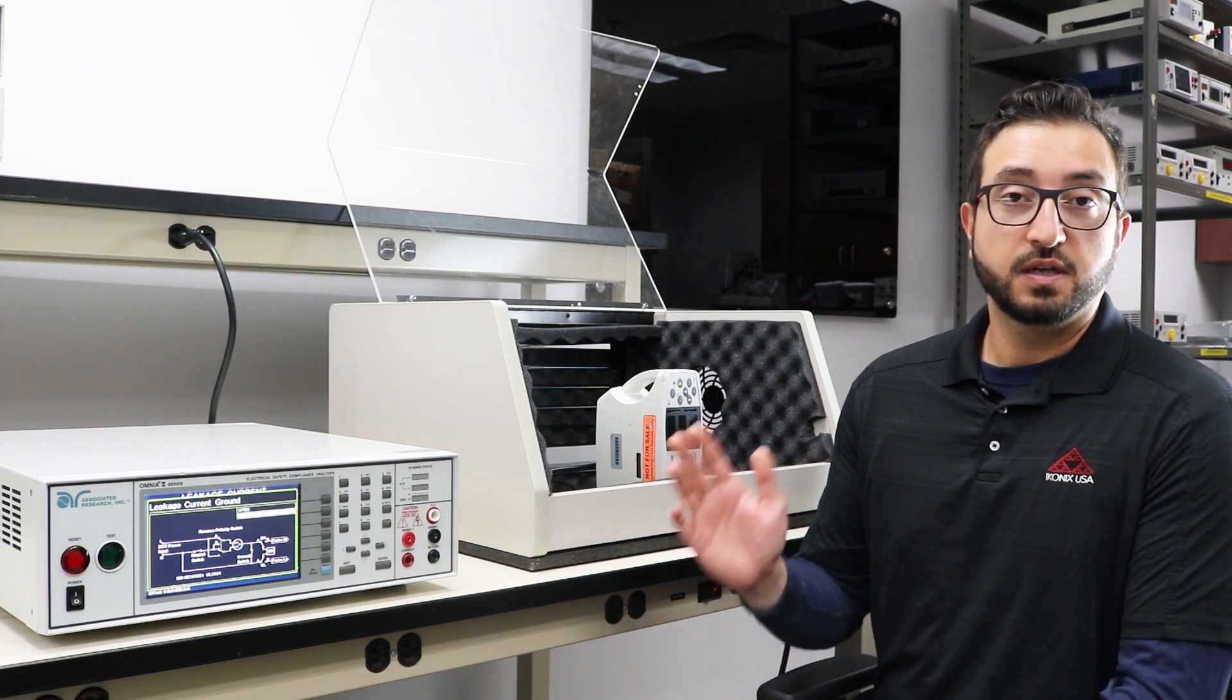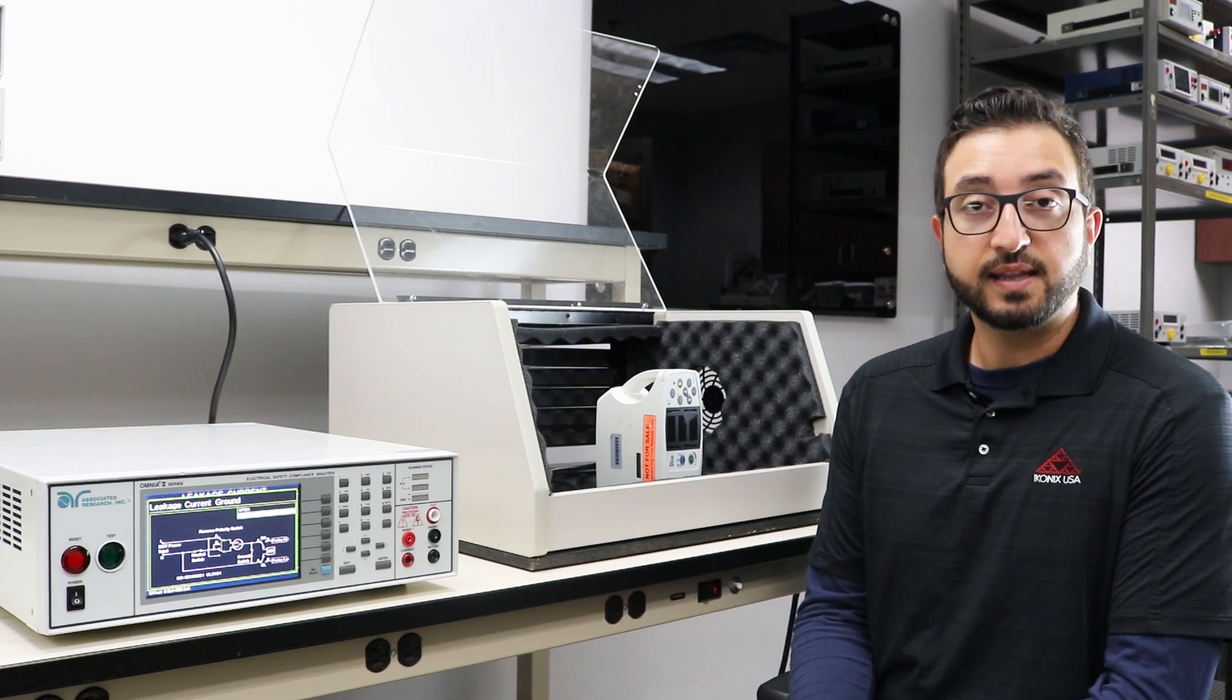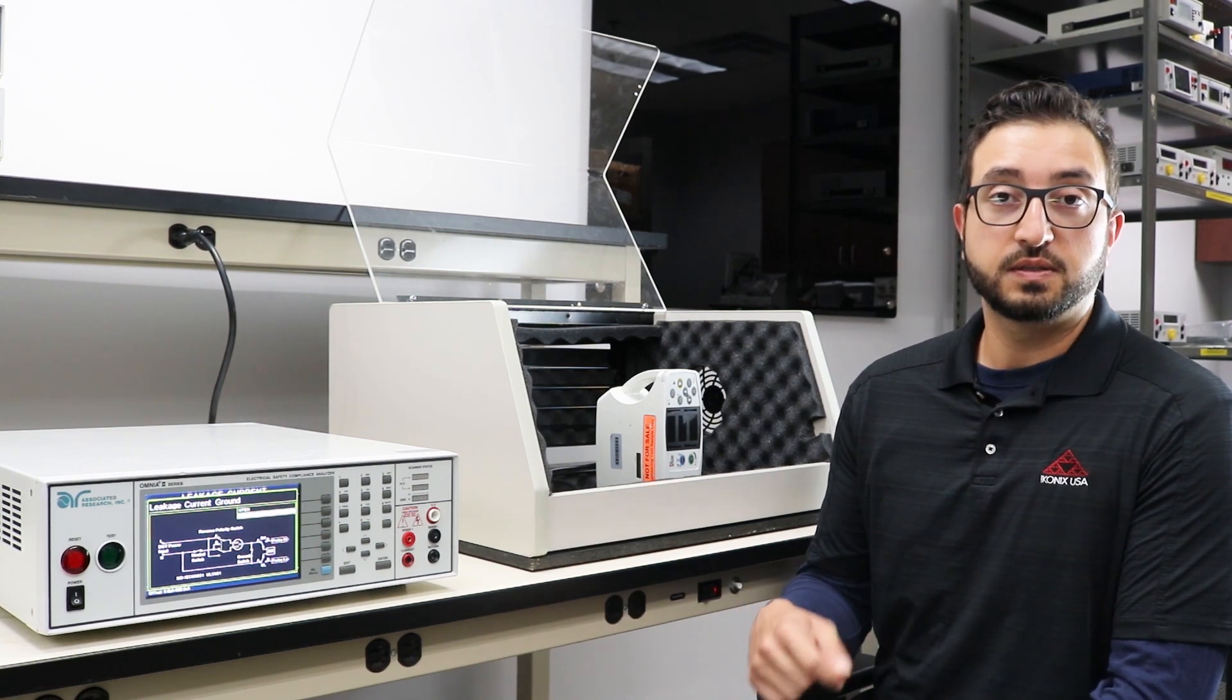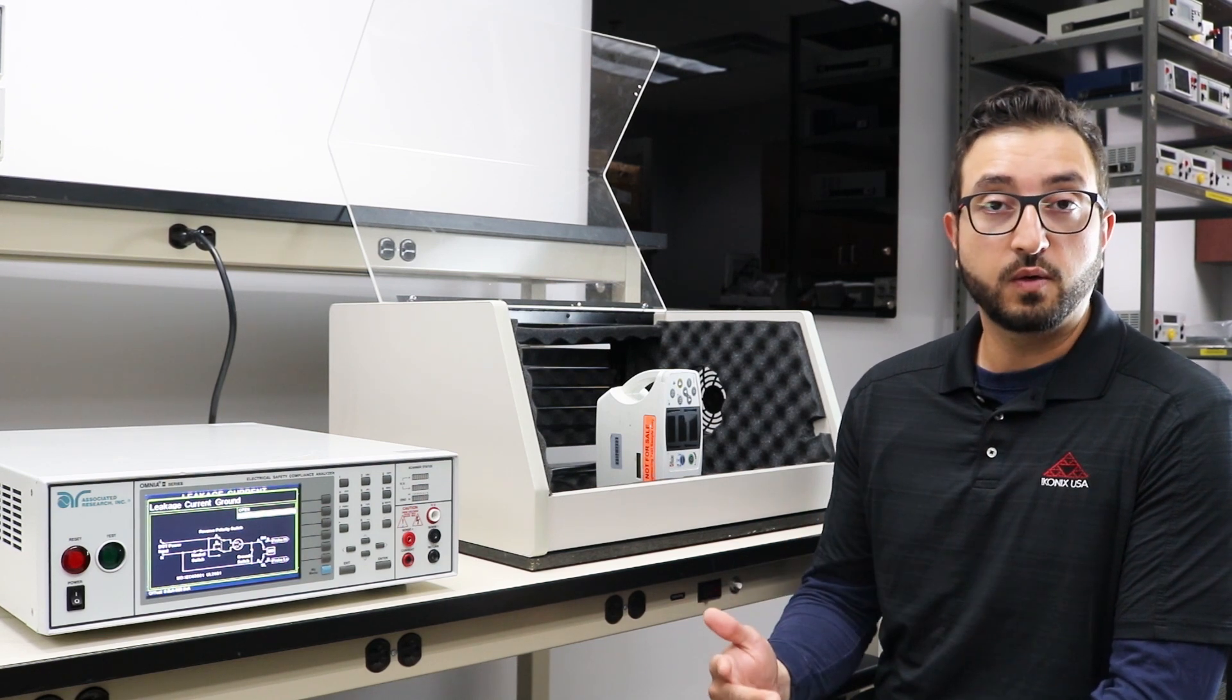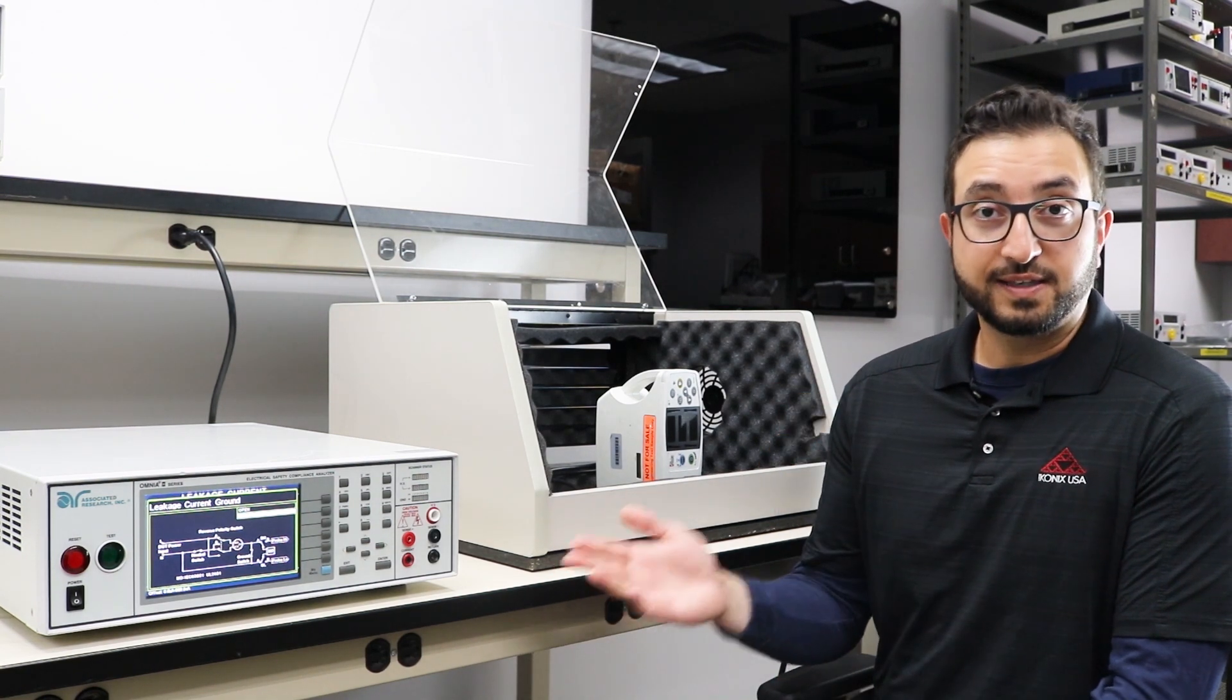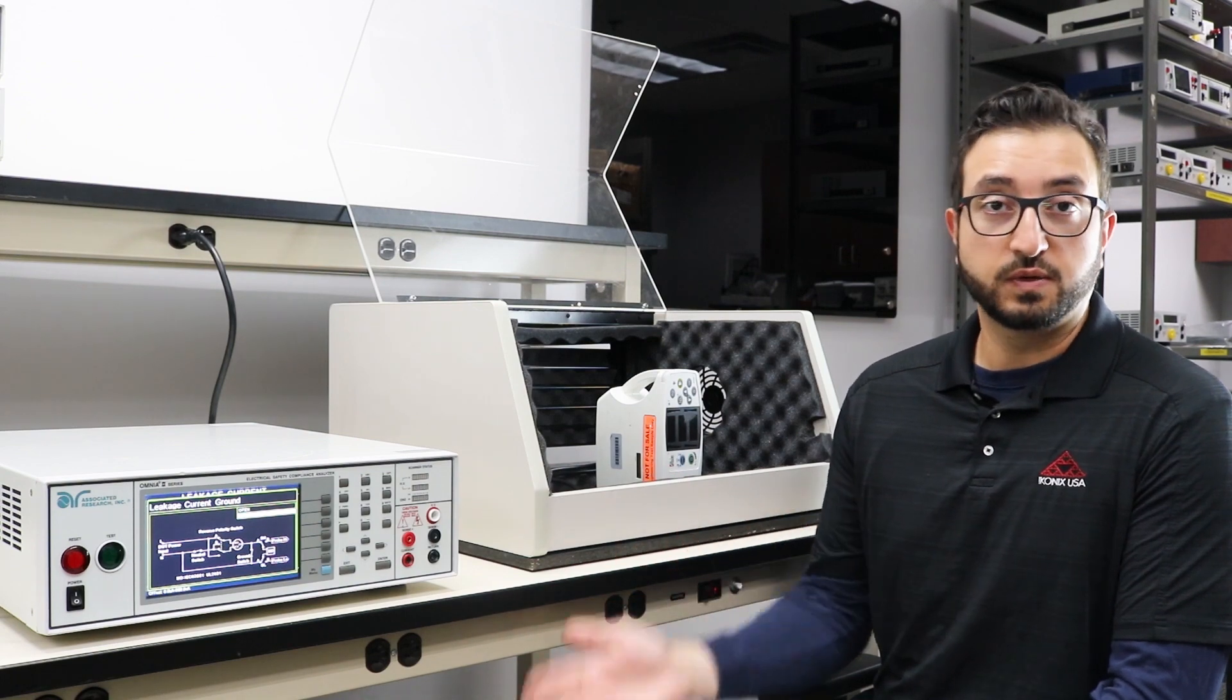What I have here is three different earth leakage tests programmed into our electrical safety test analyzer: the first one being under normal conditions, the second one with an open ground, and the third one with an open ground and an open neutral fault condition. Let's take a look at the test parameters in detail before we make the connections and execute the test.